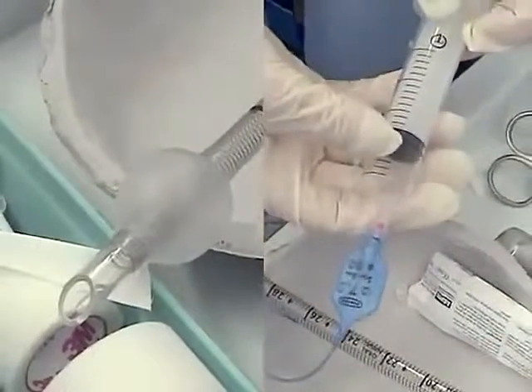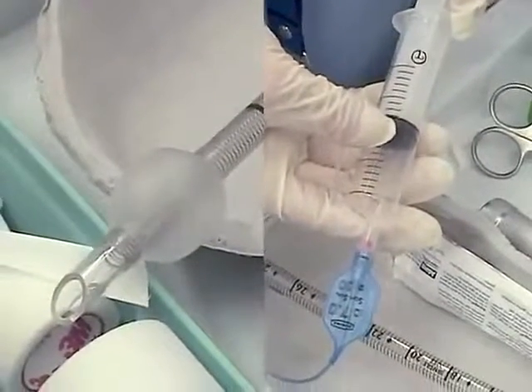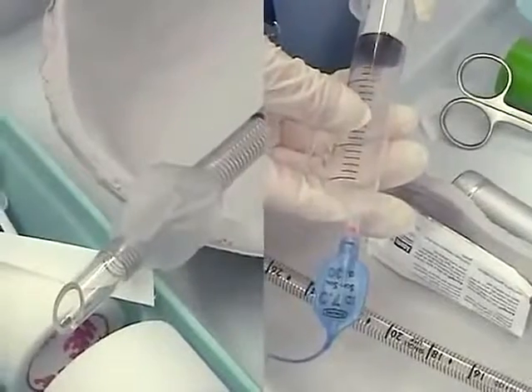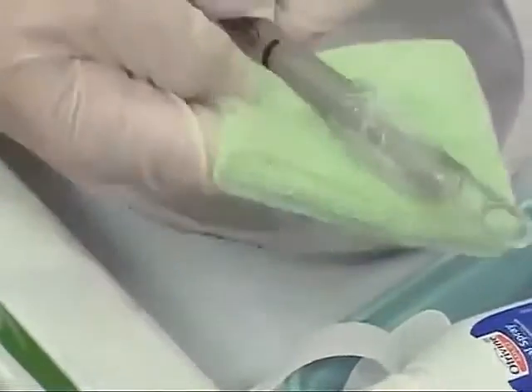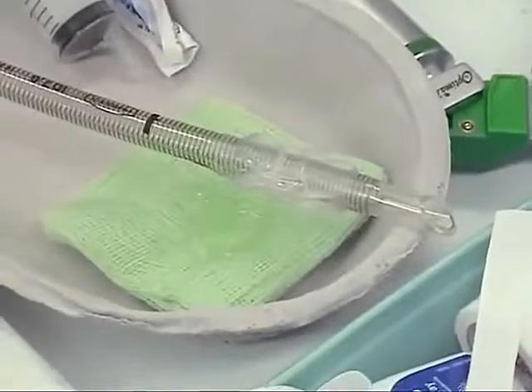The stylet should be lightly lubricated with sterile water-soluble lubricant. Then apply sterile water-based gel lubricant to the distal end of the tracheal tube, ensuring the lubricant does not enter the lumen of the tube, thereby preventing ventilation of the patient.